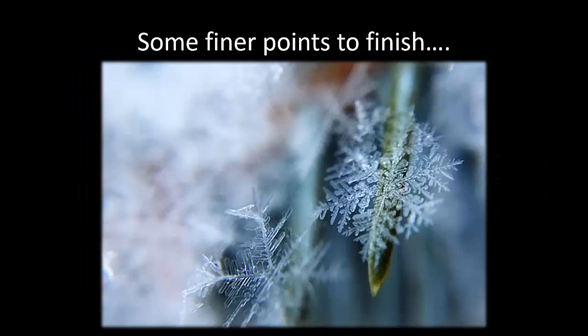And that's all there is to it. Practice will result in a kind of sixth sense about where to place your needle and how to redirect for maximum effectiveness. Here, however, are a few tips that may prove useful.